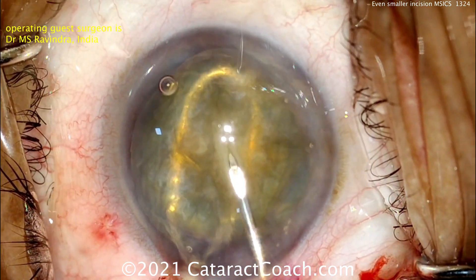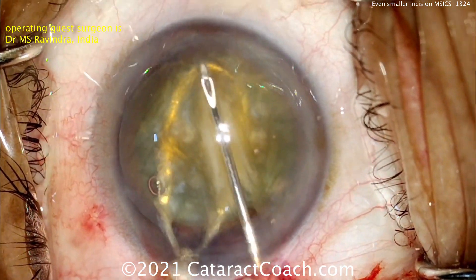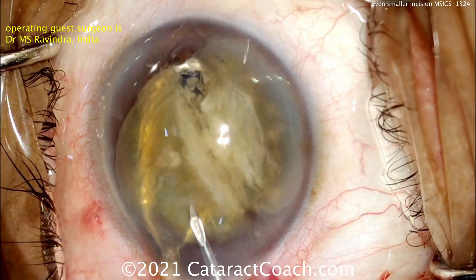Now switching to a sharp needle and using that needle to score the nucleus and cut into it. It's being supported on the bottom by the lens loop. And he just cut the nucleus — broke it into two halves. Fantastic.